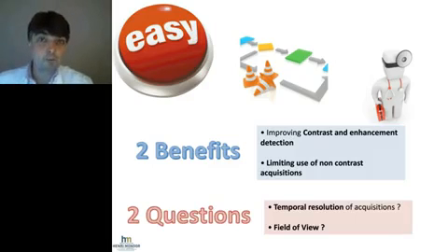First, what's the temporal resolution of the acquisitions? What I mean by that, if you're going to image regions at two different energy levels, what's the actual difference in temporal acquisitions between the first acquisition based on the low energy level and the high energy level? Now that's a key issue. And if you wonder what's the best system with spectral imaging, well, that's a key question you should ask yourself. What's the temporal difference between the two energy levels acquisitions that you're going to make?